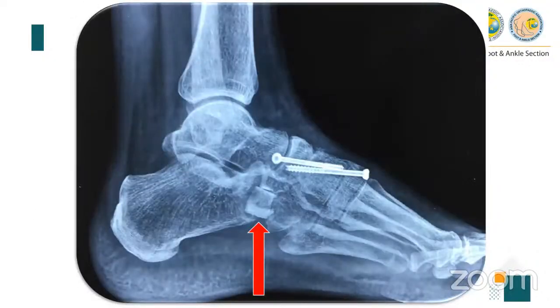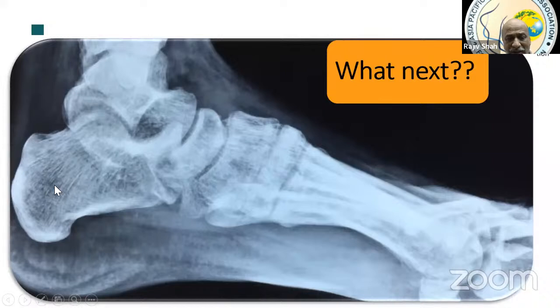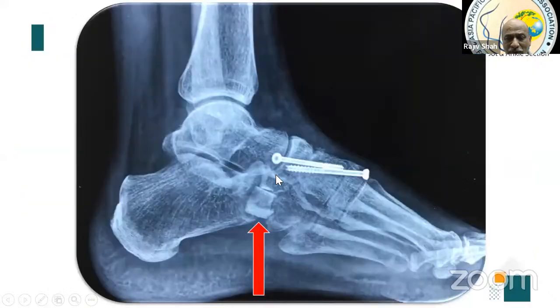So this requires a lot of undermining of skin, that plate, sir? I don't think so. But it requires complete release of the navicular-cuneiform joints to bring those cuneiforms back into action. Now if you see here, I have put in graft halfway, because I never required much of the arch restoration. And if you see, this patient already had a little cavus, so I never wanted to work more on gaining more height. So this is where it was fitted. You can put it here also.